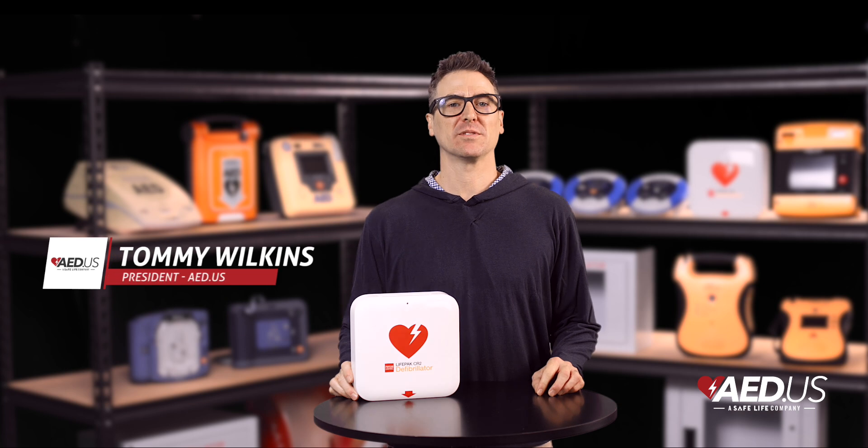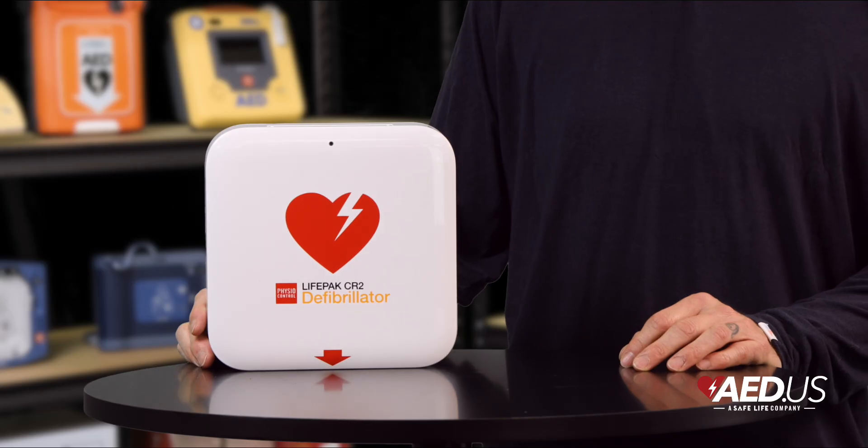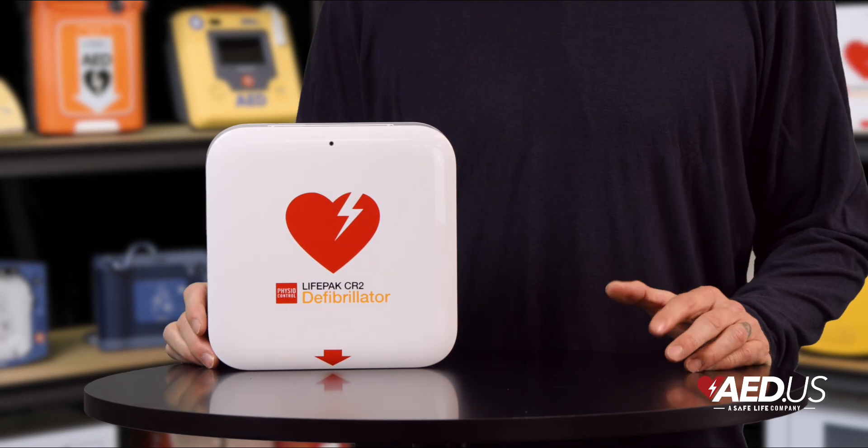Hi everyone, Tommy here with SafeLife. Today we're talking about the Stryker LifePak CR2 AED, a device so smart and easy to use, it's like having a personal assistant for emergencies. Except this one doesn't remind you about meetings — it helps you save lives.